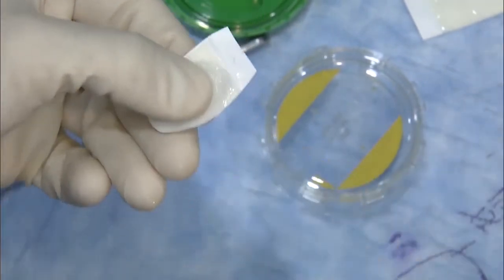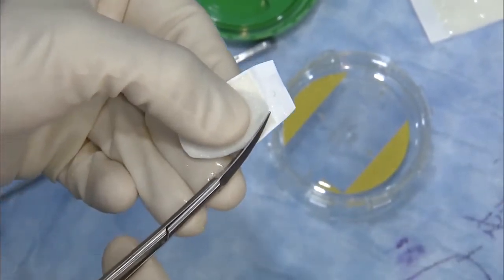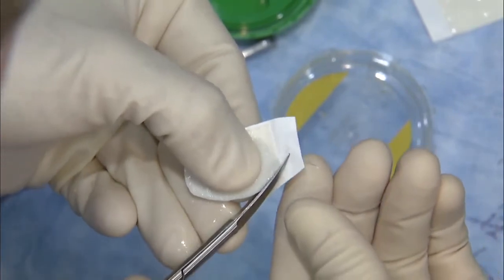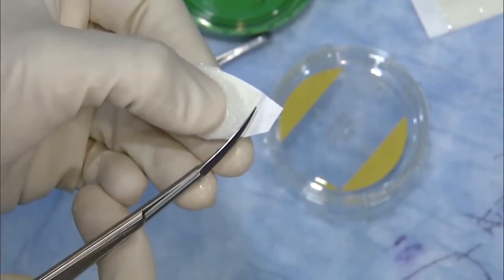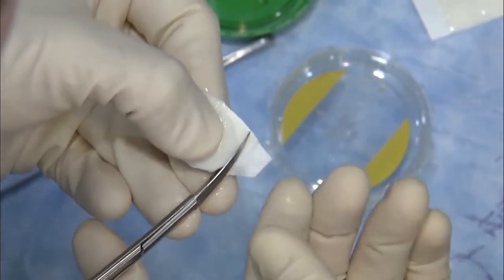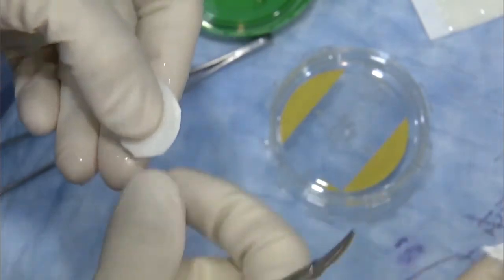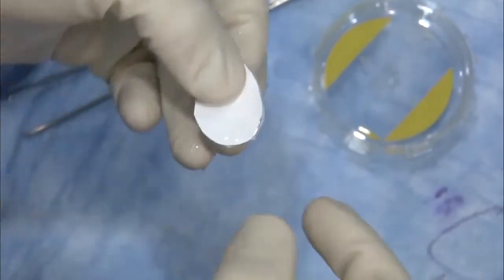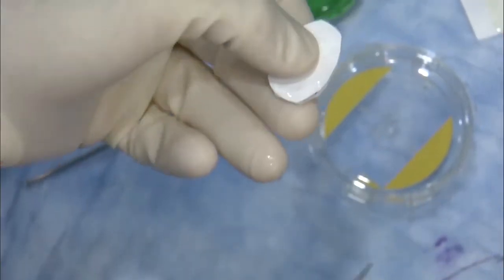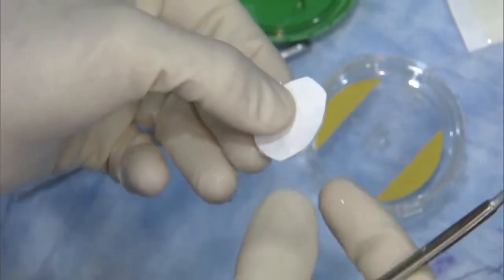Yeah, just as you said, you don't want to manhandle the graft. And that's why the cells are up with the way we've done this. So keeping that orientation correct, like you mentioned, having the notch in the bottom left, knowing that you're usually going to pick it up and invert it as you bring it up into your defect. If it's asymmetric, that's a really crucial point that's easy to forget when you're in the OR and just trying to move forward. Yeah, and then sometimes I'll flip it over.